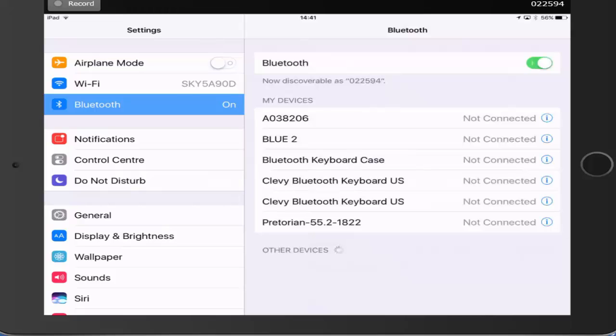Now if you've never paired the device before, all you need to do is switch the device on, and hopefully your iPad will find the Bluetooth device. I'm going to switch on the Bluetooth button. I'm just going to turn it to on, and fingers crossed that should then result in my iPad finding that Bluetooth switch. Here we go. So it's found the Bluetooth switch, it's connected. So I have a switch that the iPad recognises, and I've made sure that triple click is the way that I would escape from switch control if I get myself into a bit of a pickle.